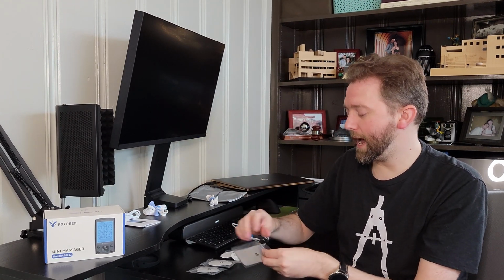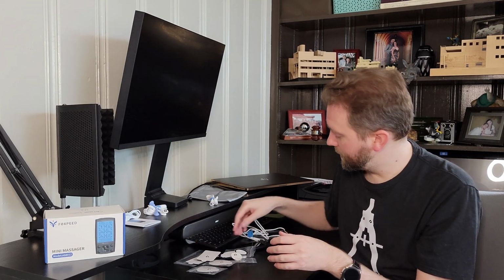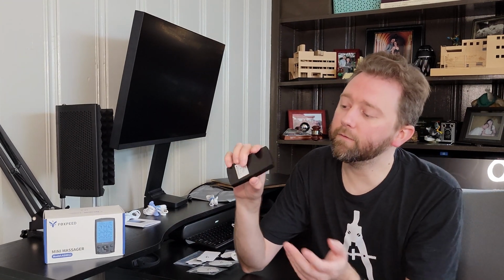And then the big boys, which is great for your back. Now, be sure to save the plastic pieces here, because when you peel this off, you need to put it back on something. You can use these multiple times until it loses its sticking ability. So there's not a little thing to put them back on, so make sure you save the plastic things so that you can put them back on it. So let's go over the device itself.